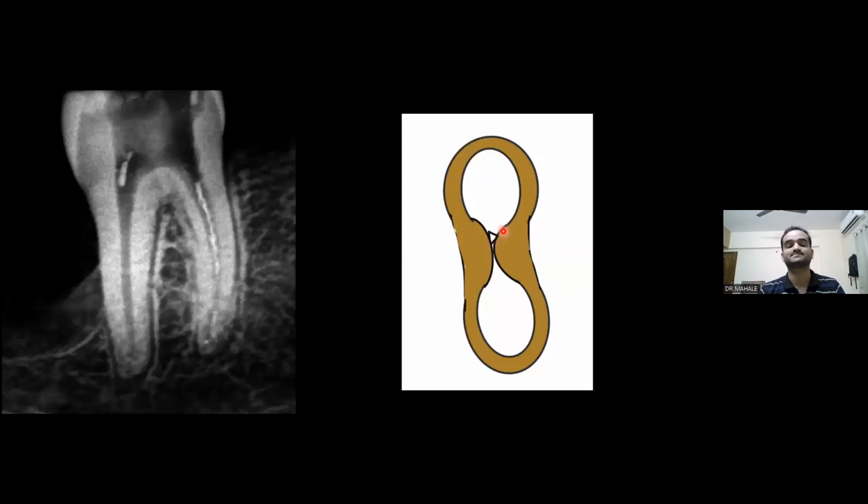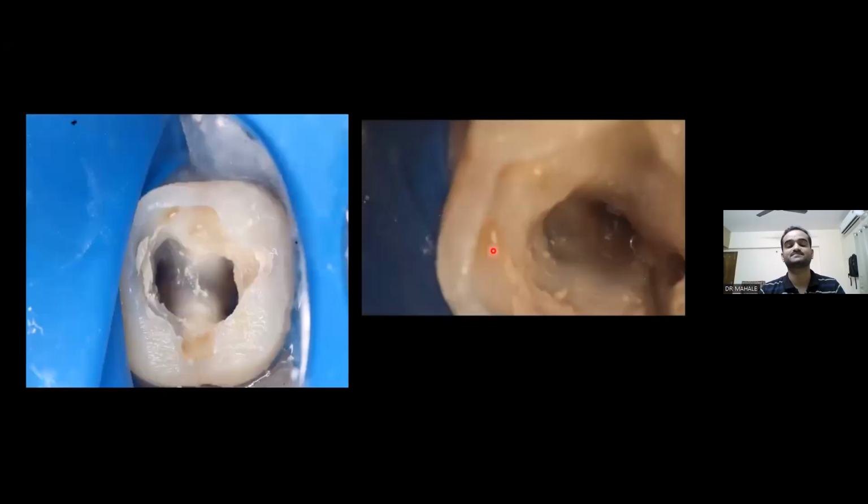So it is very safe and easier to remove the dentin in the isthmus because there is a very adequate amount of dentin present there. This isthmus is also present in maxillary premolars, where we can also take advantage of this isthmus during file retrieval.